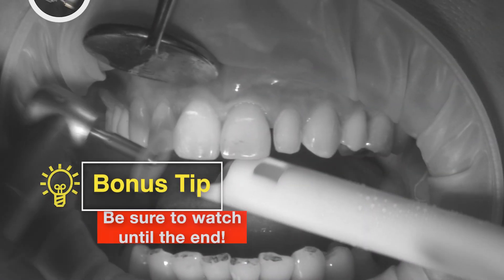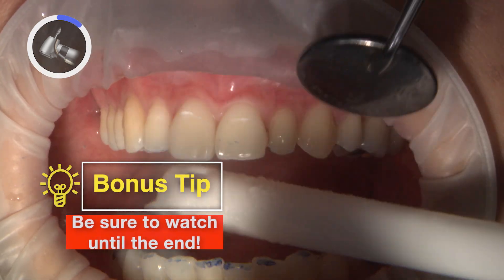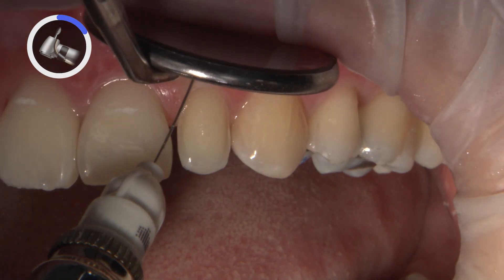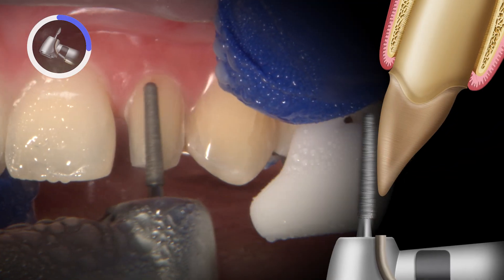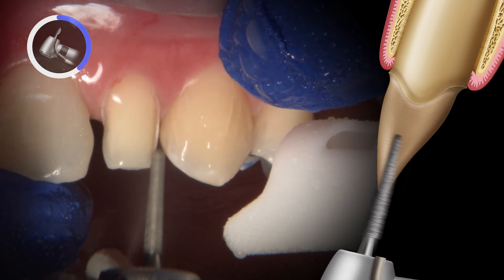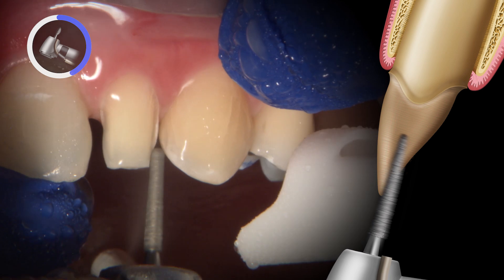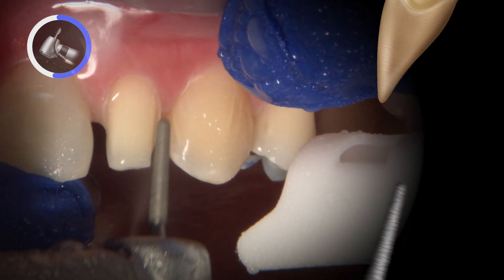Now that symmetry and harmony are accomplished through selective enamelplasty and bonded restorations, my attention goes to the peg lateral number 10. My initial approach was to restore it with a veneer, but the large gingival embrasure space between number 9 and 10 required me to place my margin more lingually to gain more aesthetics. I decided to include the lingual and plan for a full coverage restoration.